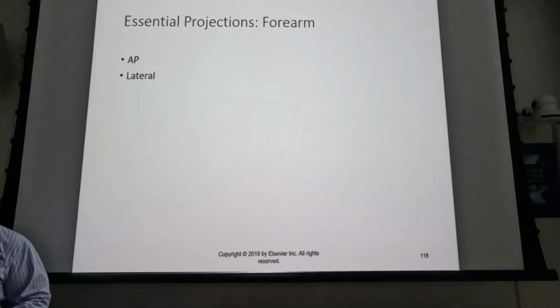Consider also that the patient may have some elbow involvement with their forearm. So what I would recommend for forearm, elbow, or even humerus, if the patient comes in really favoring that arm, is maybe don't lock yourself into an order of operation, right? We have a tendency, because we start off with a chest x-ray, we're going to do PA first and then lateral, generally speaking. Most of the time, that's how it's going to go. So we build kind of a protocol off of that, so we feel like we need to do AP before lateral, PA before lateral, and you don't, really.